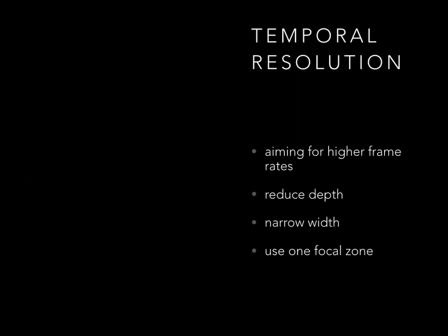Temporal resolution is the ability of the ultrasound machine to show the position of moving structures at a particular instant in time. Each image is constructed by a series of scan lines which make up one frame. The higher the frame rate, the better the temporal resolution. Frame rate can be increased by decreasing imaging depth or narrowing imaging width. Both of these mean that there are fewer scan lines.